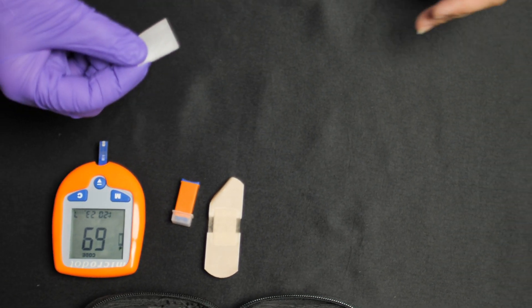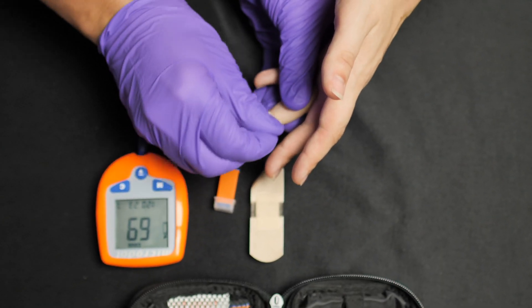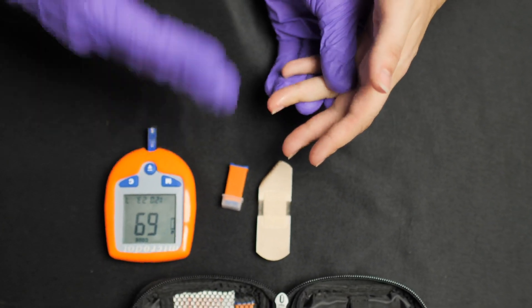Take the patient's hand and prick the side of the finger to get that blood sample. It's best to use the side of the finger — the pad has tougher skin and more nerves, so you can avoid some pain and get better blood flow on the side. I usually go with one of the middle fingers so the pointer finger isn't sore later. Take an alcohol prep pad, clean the site in a circular motion, and make sure it has time to dry so alcohol doesn't mix into the blood sample.